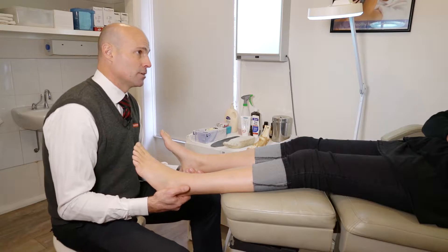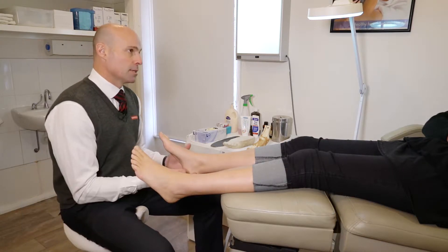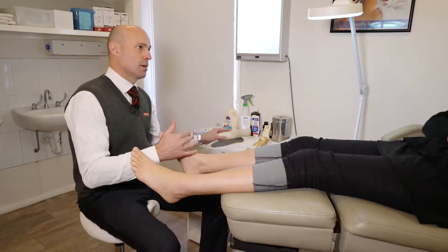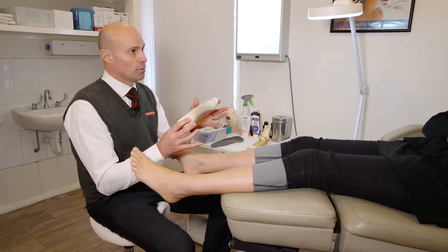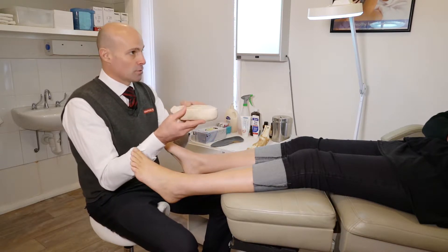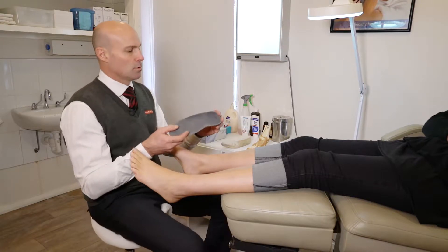We're the only company that provides support for all three arches — it's called three arch technology. Alongside that, we also provide a comfort and care guarantee, so if your orthotics aren't comfortable, we'll do them again free of charge. What I'm going to do now is wrap your feet in plaster, put the support and correction into that plaster, take it off, and fill it with liquid plaster of paris. Once that's stripped off, we end up with a positive cast of your foot, then we vacuum form different materials over that cast to produce a custom-made foot orthosis.